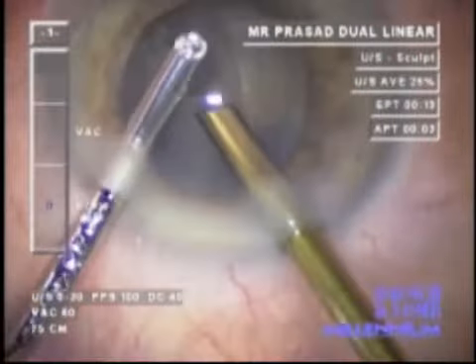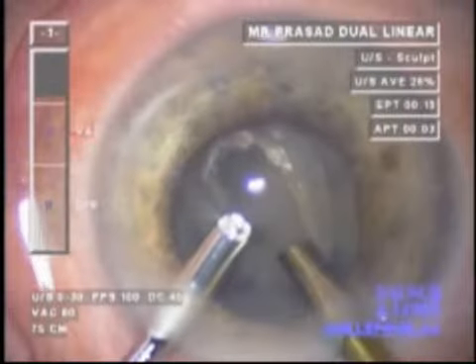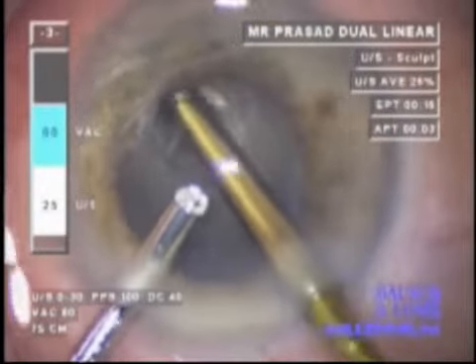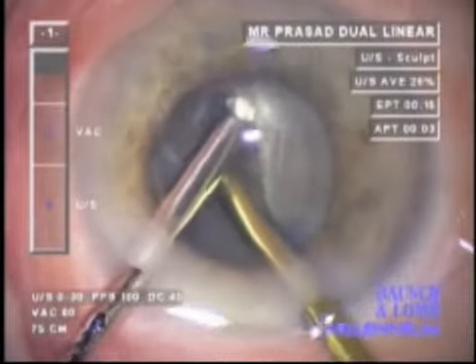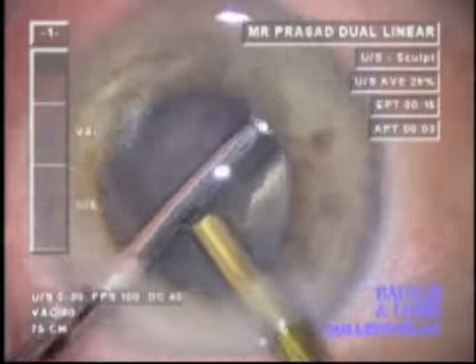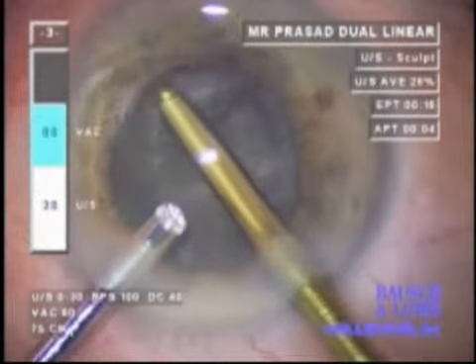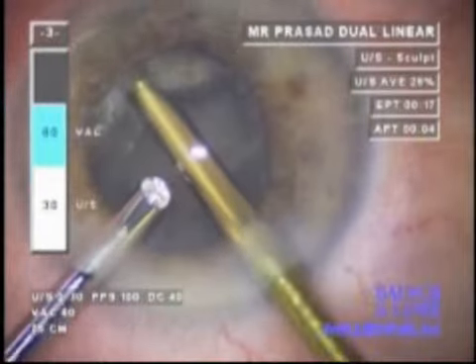Once the groove is deep enough to consider cracking, the irrigating chopper dips under the iris plane, but at that point no vacuum is employed. Without vacuum, flow through the system is minimal and the iris does not move. The nucleus can be segmented into two quadrants and rotated 90 degrees, ready for phacoemulsification sculpting in the next right-angle groove.